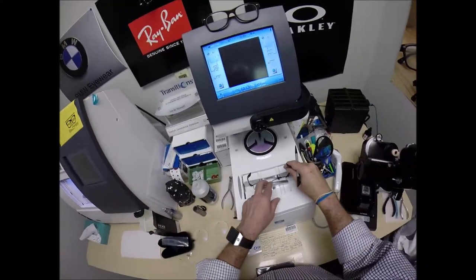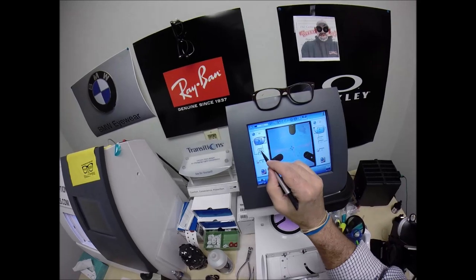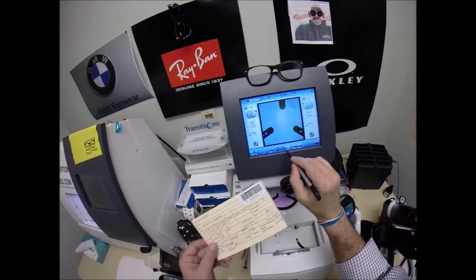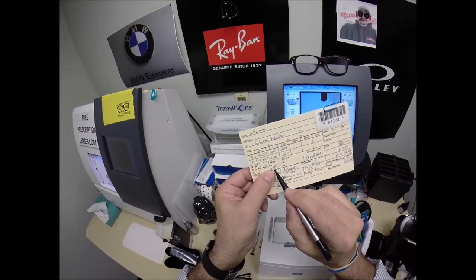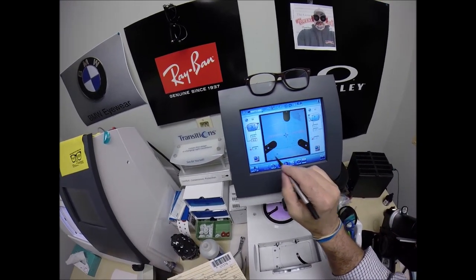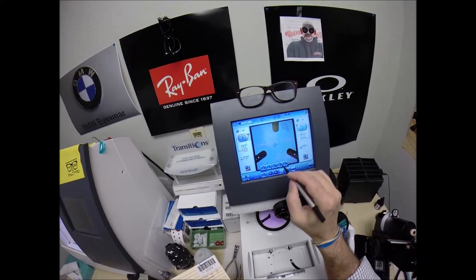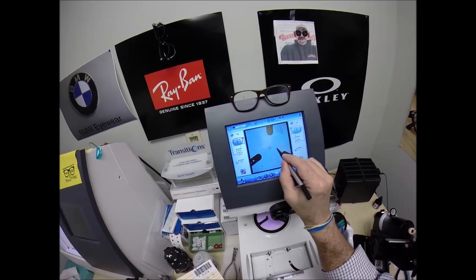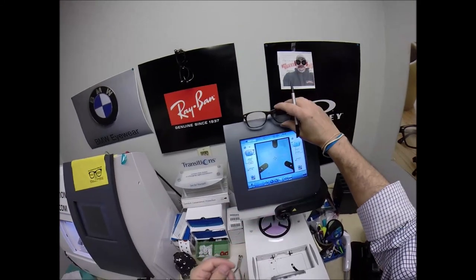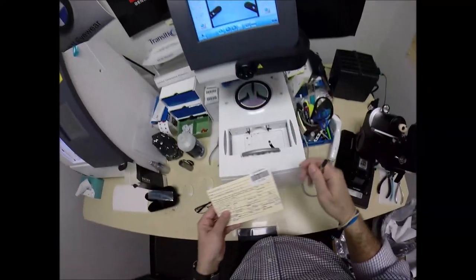Your pupillary distance is 33.5. The computer starts at 32.5, so I'm going to tap the plus button twice until we get to 33.5 — it goes up in half-millimeter increments. The invisible bifocal segment height, based on your prescription in this frame, is 18. I'm going to tap the plus button up in half-millimeter increments until we get to 18. I'm going to change the layout screen — this is for single vision lenses, but if I want a line style bifocal, I would line up the lenses that way. But these are the invisible bifocal, so I'm going to change the layout screen for that.